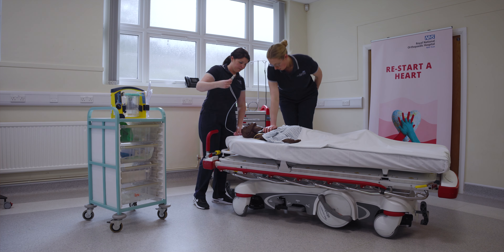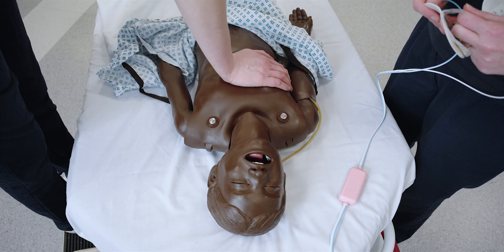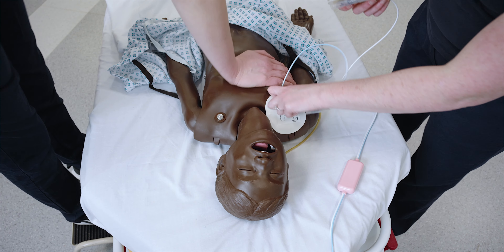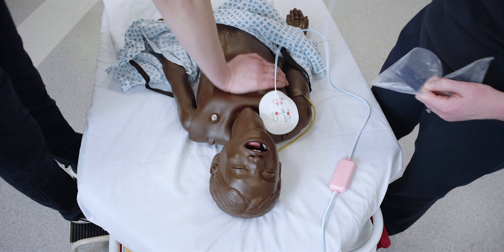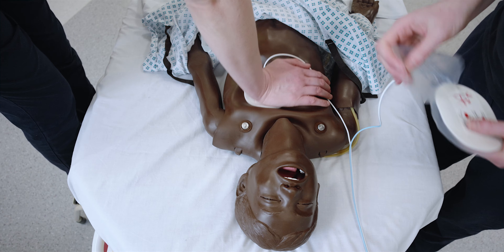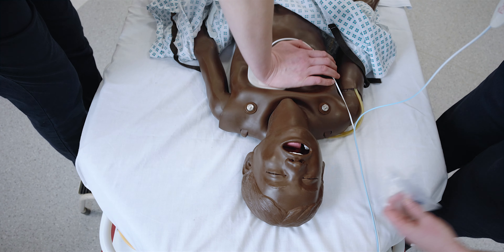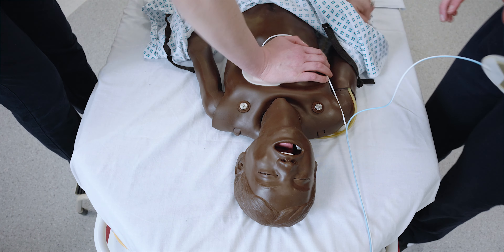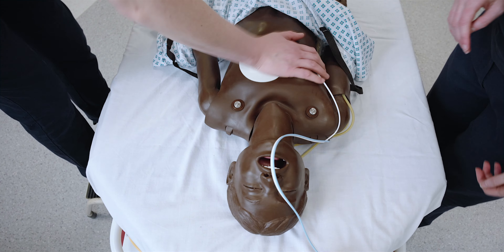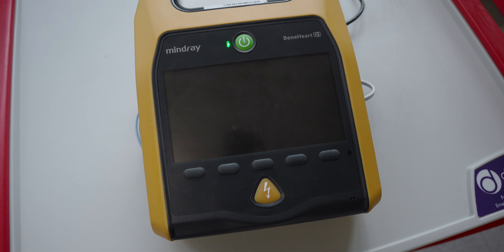While CPR is ongoing, the other rescuer will apply the defibrillator pads over the child's chest. First placement of the pad is just below the right clavicle to the right of the sternum. The other pad is in the mid-axillary line in the V5/V6 position. The alternative pad placement is anterior and posterior between the scapulae. The anterior-posterior placement is preferred for an infant.